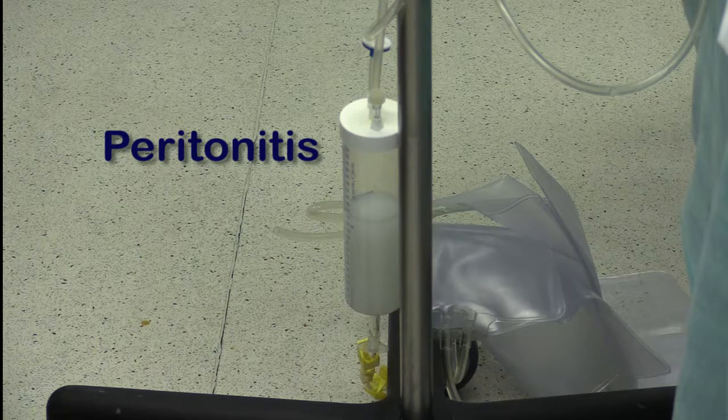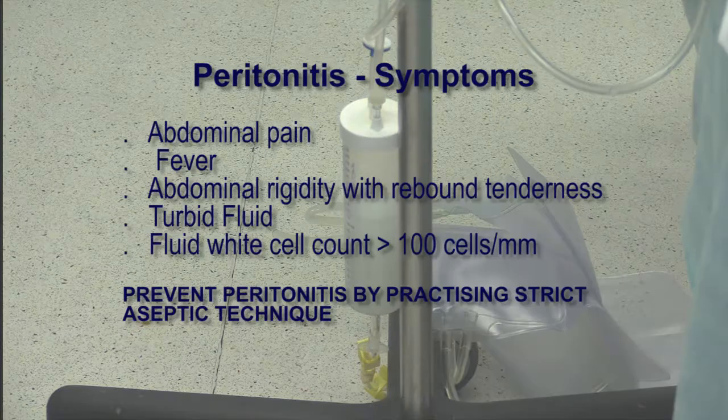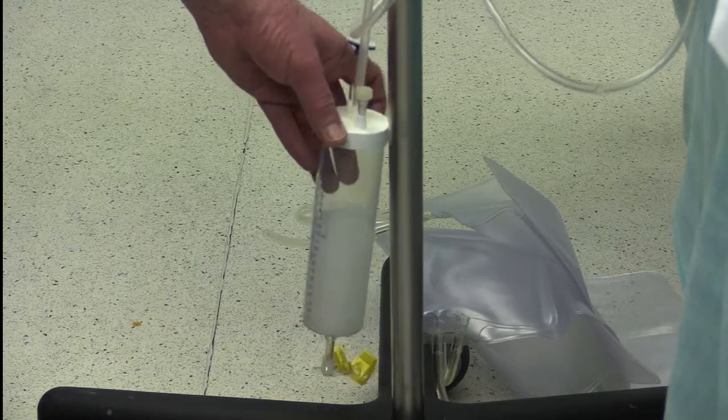A common but very preventable complication of peritoneal dialysis is peritonitis. Peritonitis is manifested by microorganisms getting inside the peritoneal cavity, and then the symptoms are abdominal pain, rigidity, fever, diarrhea, nausea, vomiting, but the most obvious sign is turbid fluid, as seen here in the outflow in the burette.